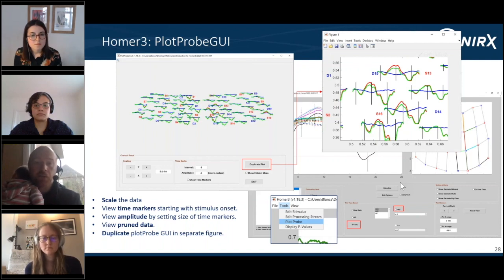In fact, there's a module called Run Homer2 that allows you to take any of the code in Homer2, like your favorite motion correction algorithm from Rob Cooper, and put it into my toolbox within the same framework. So we can call any of the Homer2 functionality, and then the Homer3 functionality when I get around to implementing that.